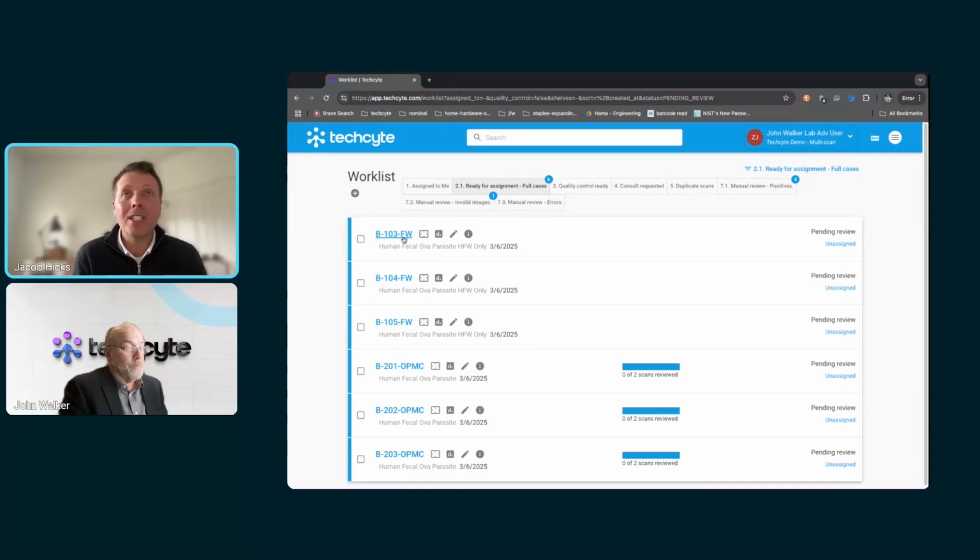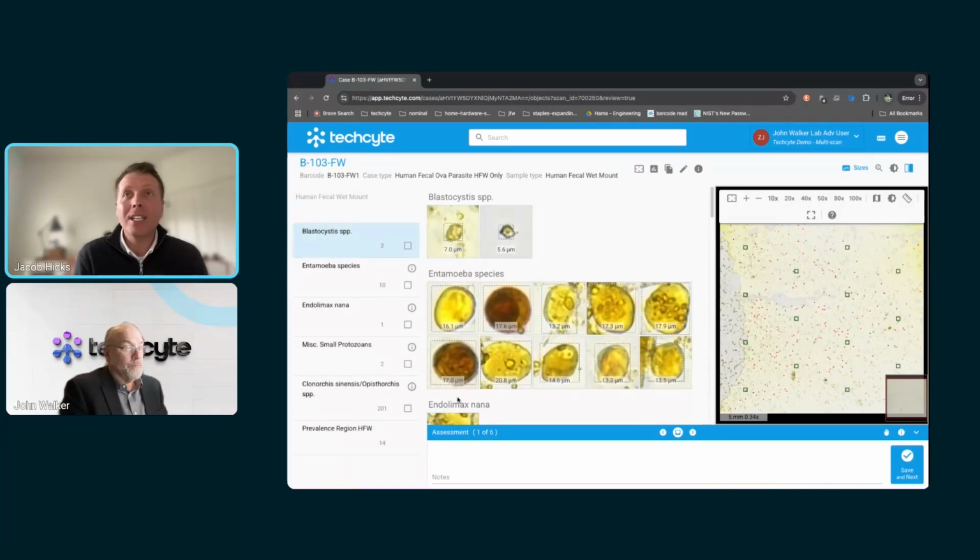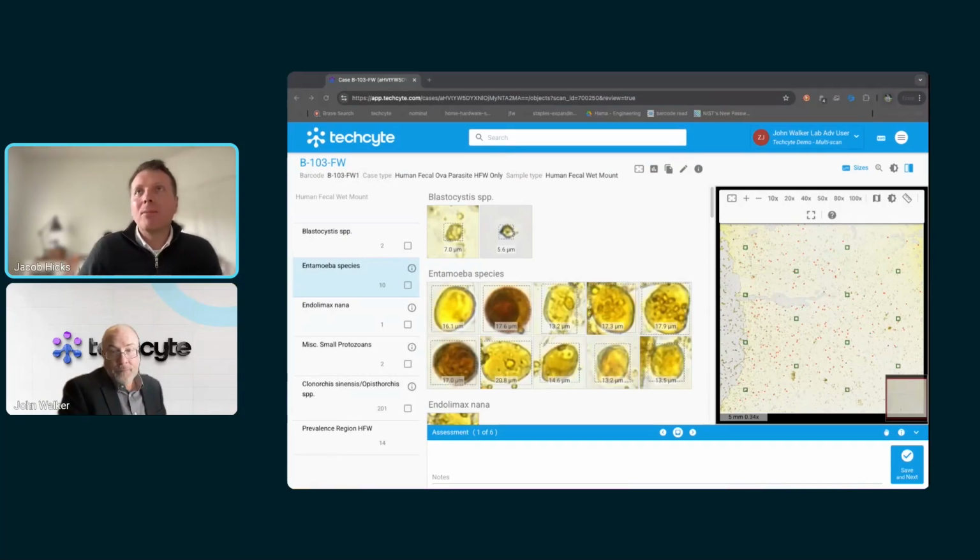And so Techcyte has devoted its resources to getting these laboratories going live with this solution under their own in-house or laboratory developed test. Techcyte is eventually pursuing a 510(k) submission. There has not been one. We just have had some Q-Sub conversations with FDA. Great question, Margaret.